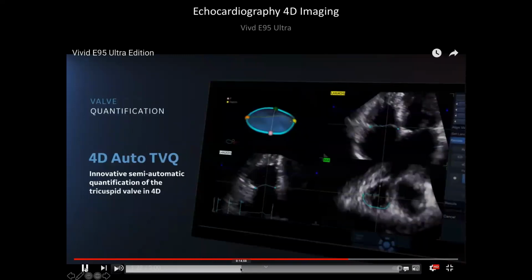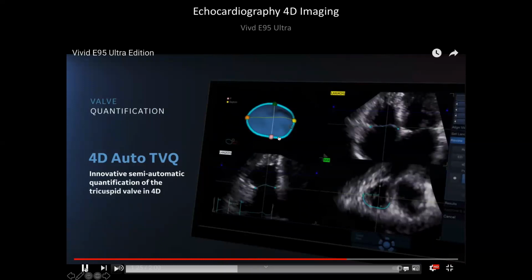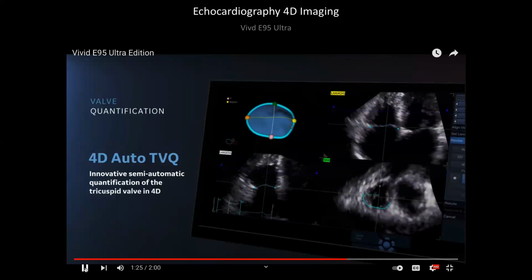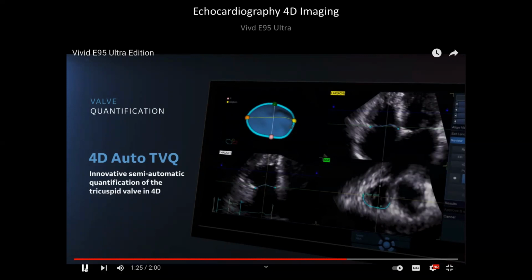And so here is using echocardiography, using the raw data itself to come up with sizing for a valve that you're going to implant. Boston Scientific or Medtronic, whoever's making this valve, they sell it in many sizes, right? There's usually about 5 different sizes.